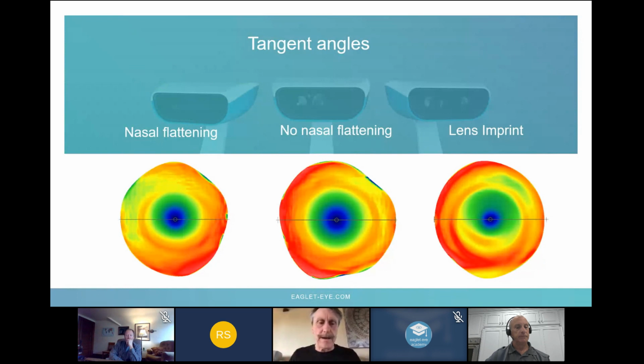This is Kyriakos, I think. And basically for that whole weekend, the eye that's clear of the lens, drops and drops and drops. So when that guy or girl comes in on the Monday, let's say, then that eye is super lubricious and super easy to get the impression. And then you do the same for the other week. Thank you, Brian. Thank you, Barry.